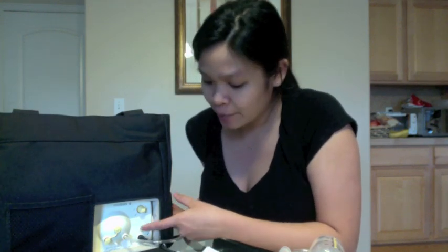These little pulses mimic when the baby first latches on, they do quick little sucks. And this is what happens to get the milk to let down. Once your milk has let down, then what you want to do is press this button right here, and it has a couple drops next to it to signify. What it's going to do is cause the suction to get slower and stronger. So longer suck, like the baby's actually drinking something. So here you go. Hopefully you can hear it.